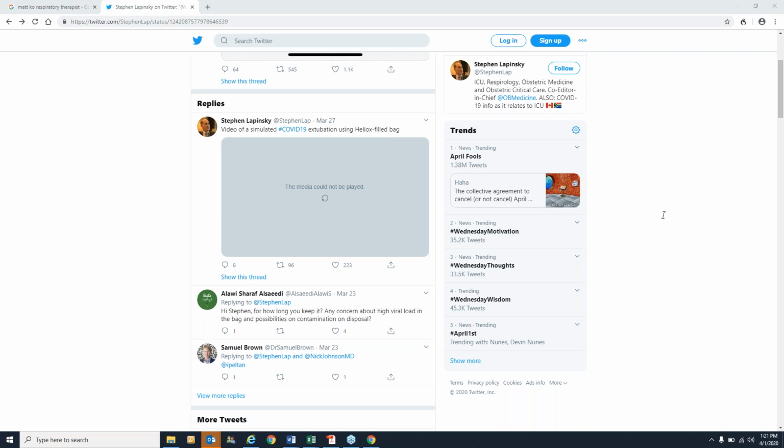Here's a good comment. This is Kevin DeYoung, and I know Kevin. He's talking about your process with the bag and extubation. Here's his comment: We came up with a negative pressure room process. We will test further. We take a clear plastic bag, put it around your hand, and remove the ETT like you were grabbing dog poop, and pull the dirty ETT into the bag. Working through the kinks now, also thinking we could minimize the number of staff in PPE and therefore the viral load during this procedure.